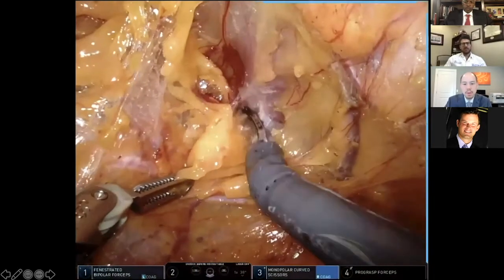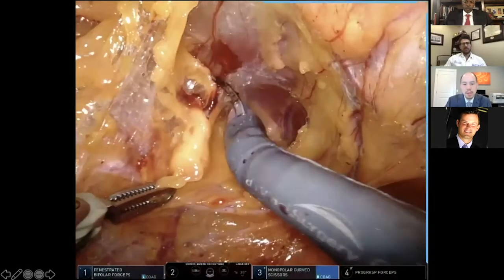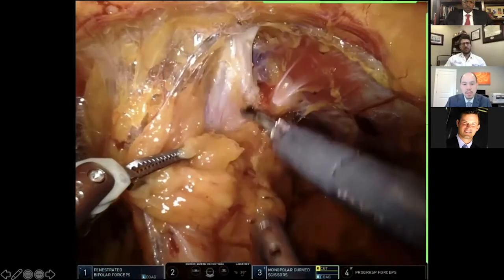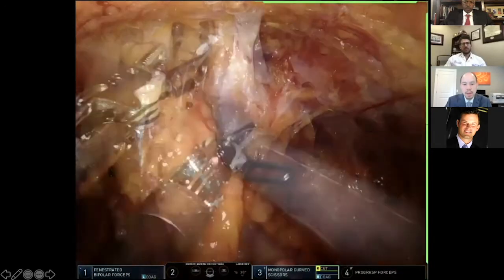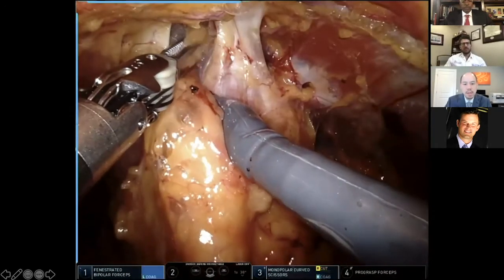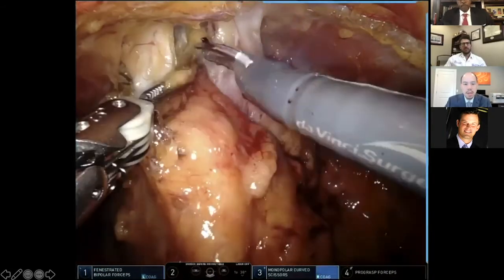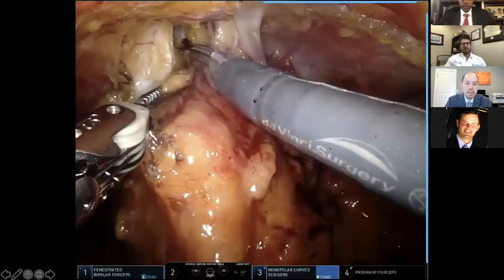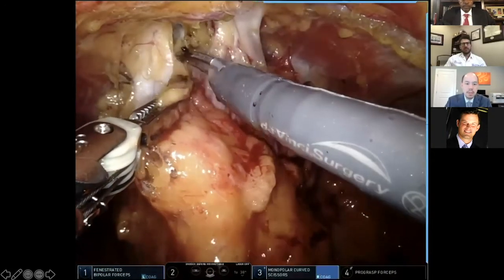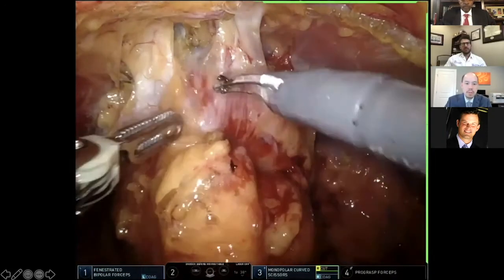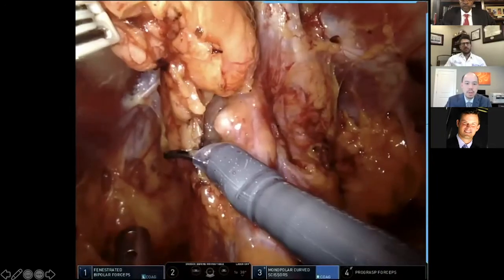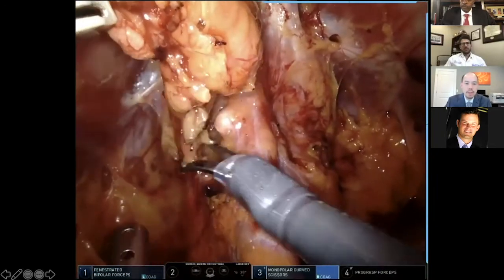It's important here, as we dissect the lateral corners, to really dissect away the tissue and mobilize the bladder off the endopelvic fascia, and then deep down to the obturator space. The superficial dorsal vein is usually cauterized here, and then we'll defat the prostate.